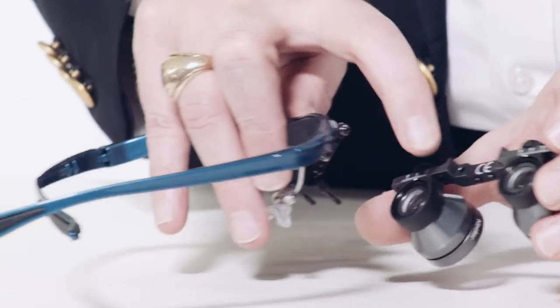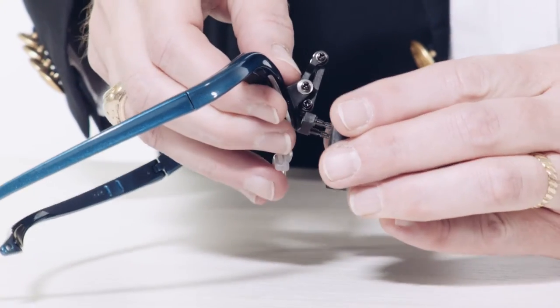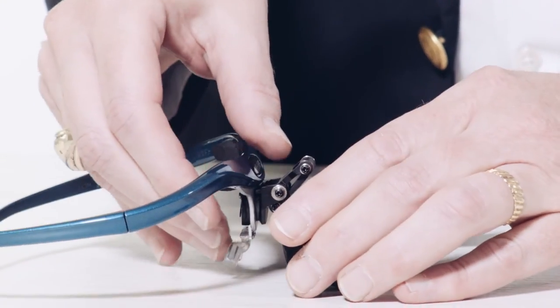Keeler loops are fit to the frame hinge by holding the loop PD bar and pushing the loops onto the hinge pins.